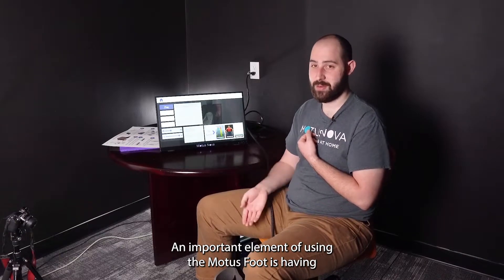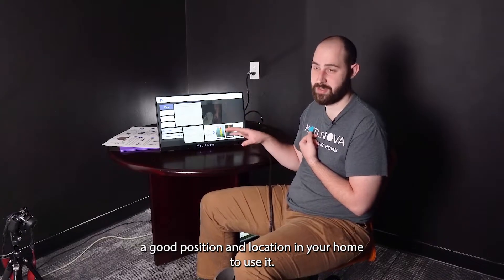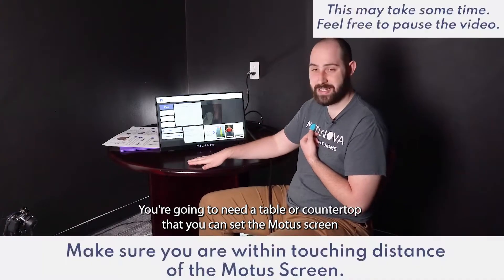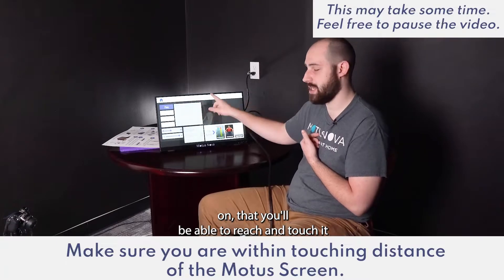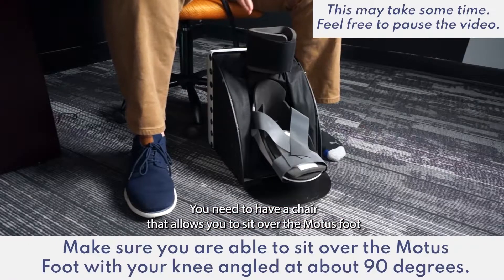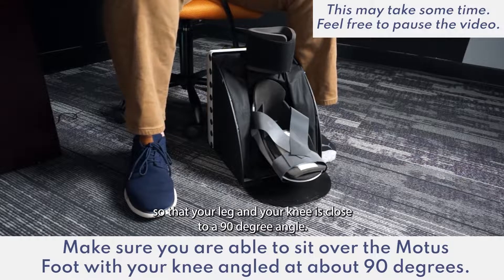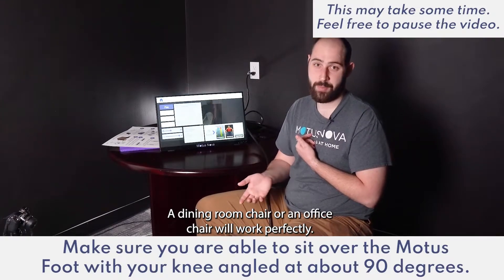An important element of using the Modus Foot is having a good position and location in your home to use it. There are a couple of elements that are important with this. One, you're going to need a table or a countertop that you can set the Modus screen on that you'll be able to reach and touch. Two, you need to have a chair that allows you to sit over the Modus Foot so that your leg and your knee is at close to a 90 degree angle. A dining room chair or an office chair will work perfectly.